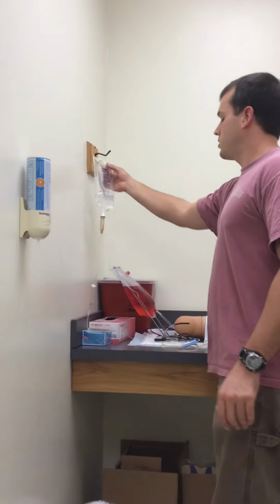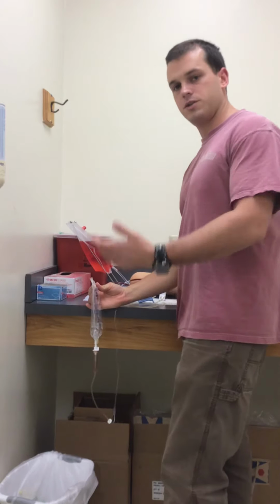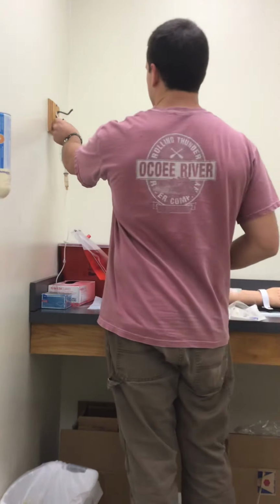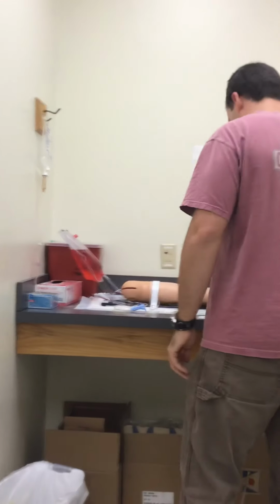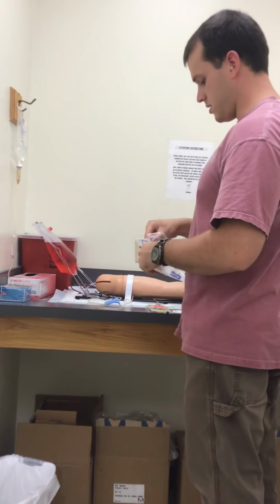I'm going to take my primary, put it below the level of the arm, make sure that the IV line is still patent, and see that I get blood return, which I do. And at this time I can go ahead and set up my secondary.